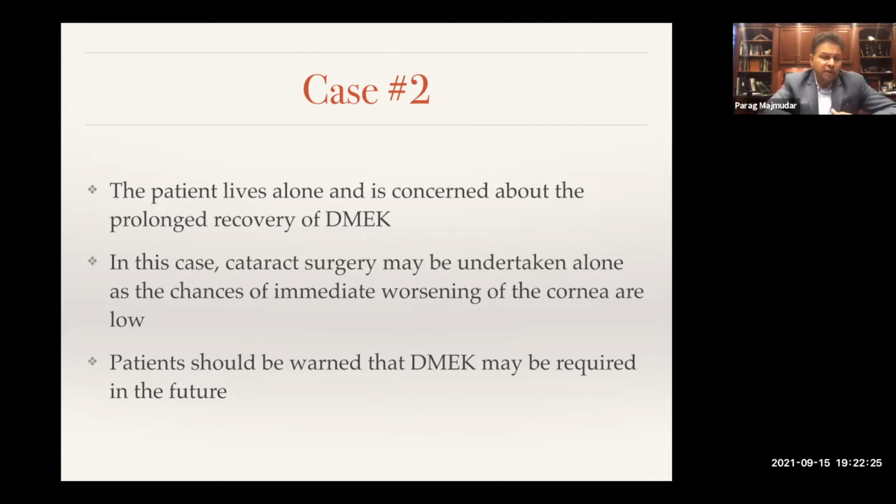And let's just do the cataract surgery, get you functioning a little better. This patient's vision was 20/60, 20/80. If I get her to even 20/30, with a little glare from the mild few guttae that she has, I think she'd be much more functional and she'd probably be happy with that. And so we gave her the option. I said, I'm happy to do both. I think you do have a little bit of cornea issues, but I think here the primary consideration for me was cataract.